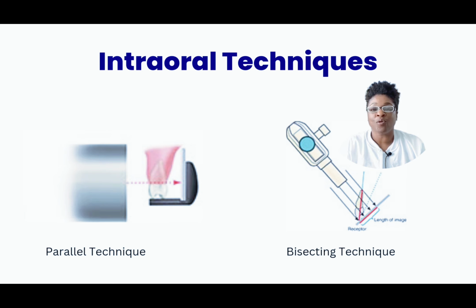However, if you do want to know what the techniques actually are, why we use one over the other, how to execute these techniques, you definitely want to check out my video on the paralleling technique versus the bisecting technique. And again, these two techniques, paralleling and bisecting, are both techniques that are used intraorally. All right. And the one that we prefer in dentistry that they're going to ask you about on that radiology exam is going to be the paralleling technique. So we do want to do the paralleling technique any opportunity that we can.